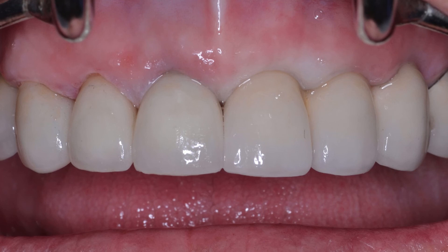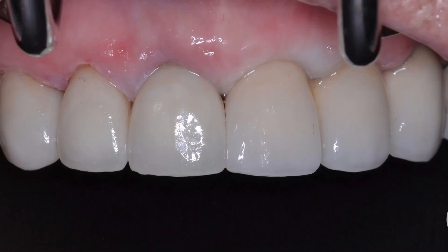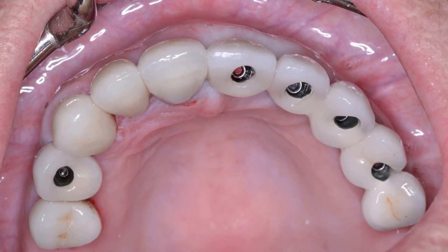All the other teeth are cleaned up and the remaining crowns are cemented following standard crown and bridge insertion procedure — checking each crown individually, then all together, verifying contacts, margins, and occlusion. There is a small black triangle between the front teeth between the lateral and central incisor. This will be alleviated easily: as studied by Tarnow, as long as the contact point is 5 millimeters from the bone, a papilla will form. Using regular rubber tipping will promote papilla formation in this area.